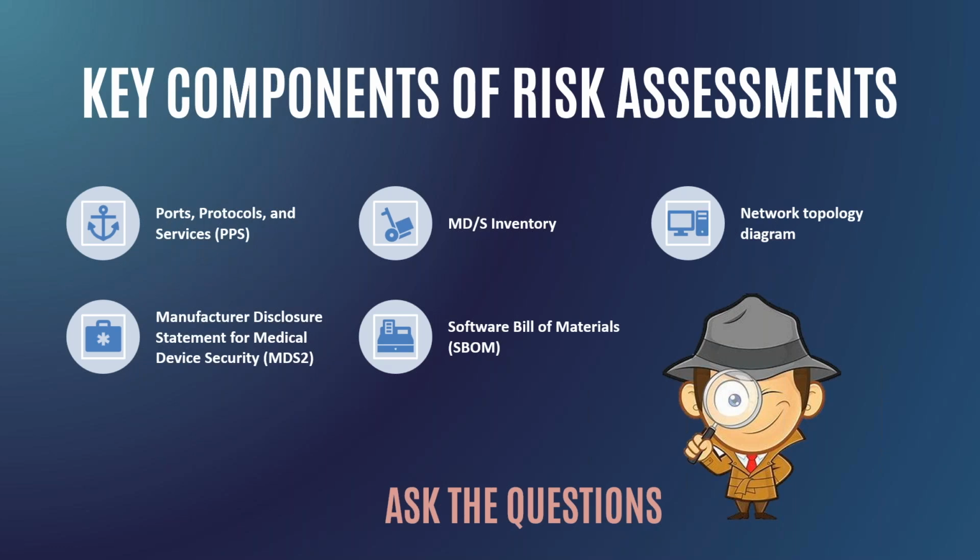A lot of times when you're assessing the medical equipment, you might have a cool new technology that you want to implement. So a couple of things that we usually ask the vendor for at the start, because in the risk assessment, you need to understand how the medical equipment works and how it's integrating with the hospital. So we start with the ports and protocols, because you want to understand the networking behind it. If you're segregating your system, then you need to understand the ports and protocols, how it's communicating. Is it communicating to a cloud environment? Is it communicating to a server?